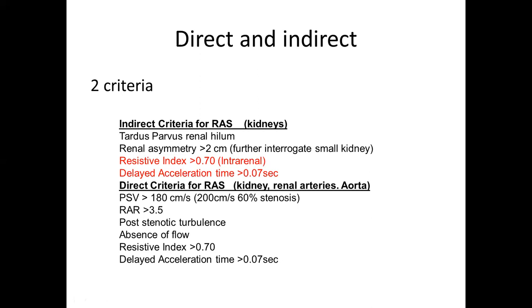Are they of normal size? Usually, if there are problems with blood supply to the kidney, it may shrink in size. So we are looking at smaller kidneys or a difference of more than 2 centimeters, in which case you have to interrogate the smaller kidney.